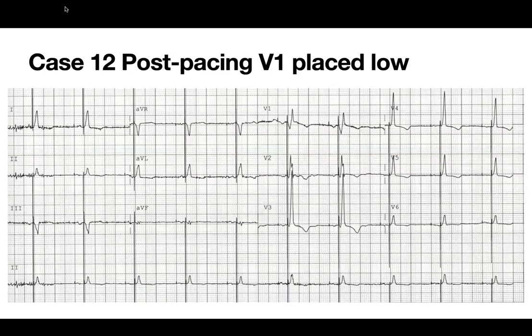And I think it's more than 5%. Honestly, having done around 40 cases now, I think it's more than 5% that you don't have a big R prime in the standard V1 position. Maybe more like 15%, I don't know. Go next.